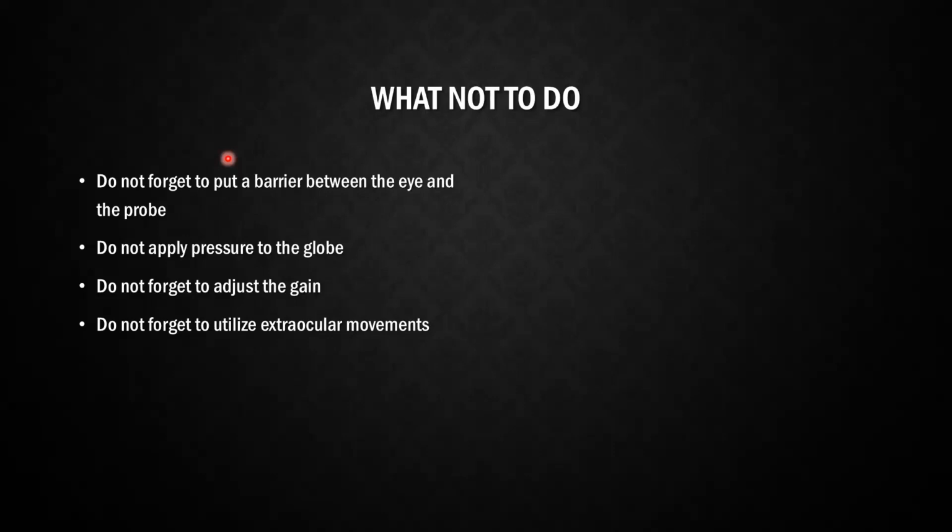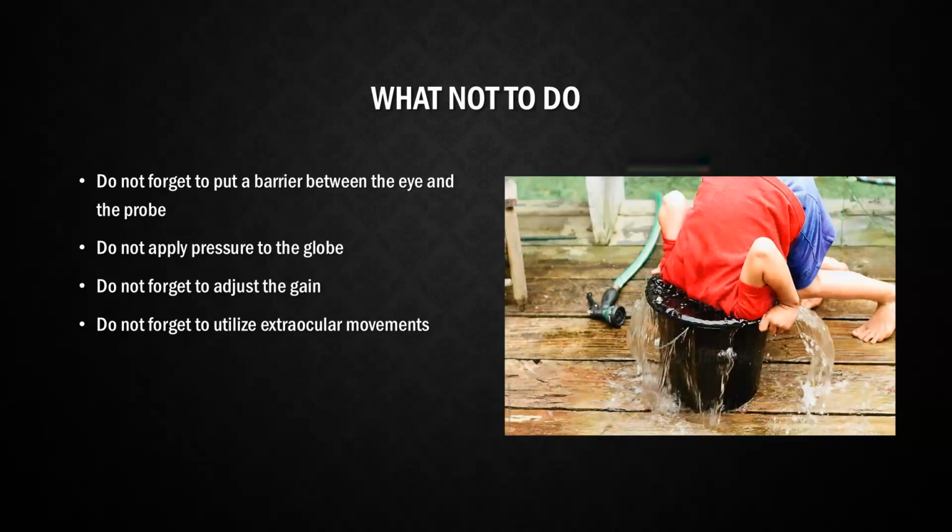And then don't forget to use the extraocular movements. Obviously scanning through in two planes is a big part of this, but the good thing is that when people can move their eyes, you can look in all of the nooks and crannies and hopefully you won't miss anything. And then don't use a water bath. I think that would be in poor form to stick your patient's head in a water bath for this, though it would be kind of cool to do ocular ultrasound in a water bath.